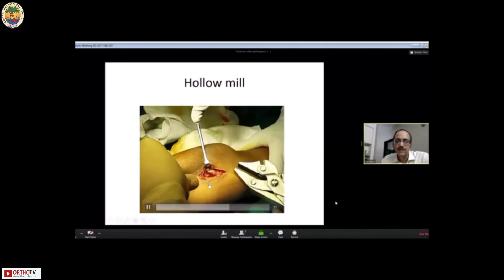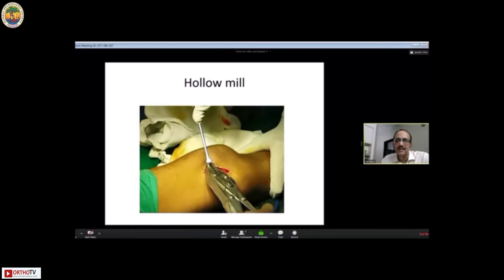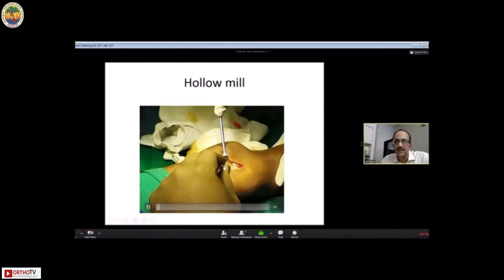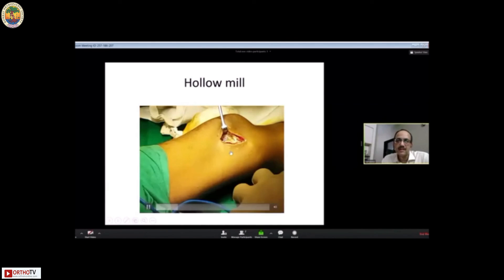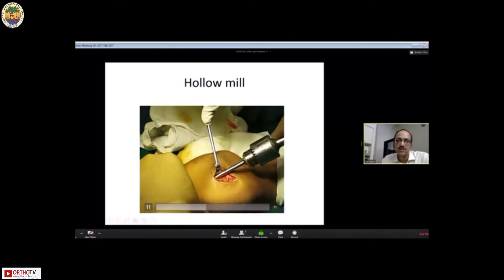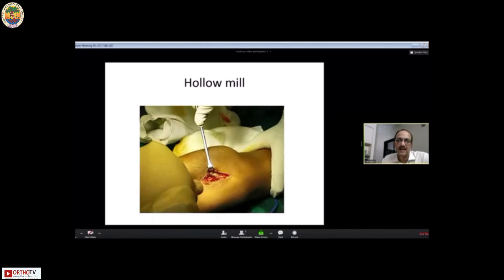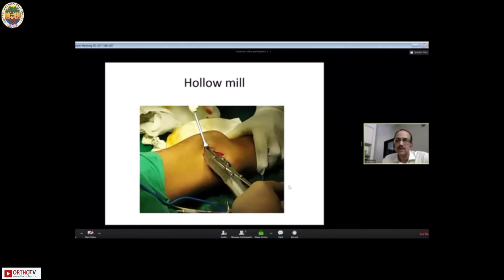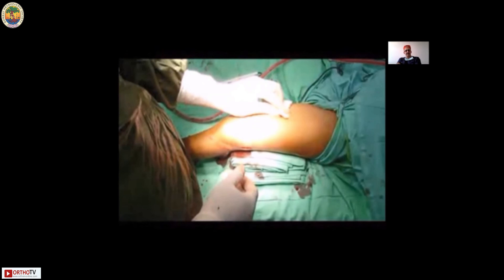To summarize: one centimeter of nail is usually left outside flush with the cortex after exposure. Pass a small hollow mill around it against the cortex, turn it 90 degrees, hold it with a plier at 90 degrees, and back-hammer it out. Sometimes holding the tip directly is very difficult as it keeps slipping, so this is a very useful tip. I hope these tips and tricks of titanium elastic nailing will help you in your day-to-day practice. I thank Dr. Nitin Deshpande, President MOA, for this great initiative to share surgical skills with all MOA members so that everyone can benefit. Thank you very much.